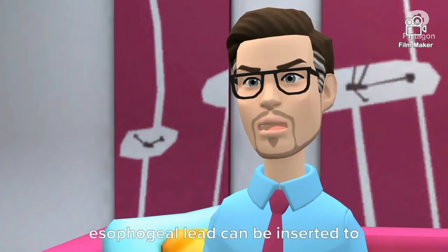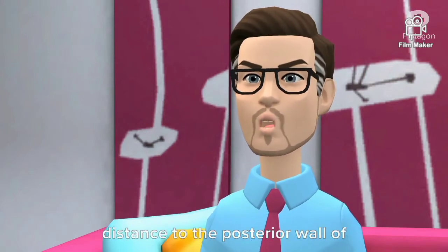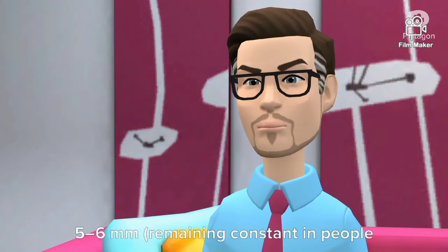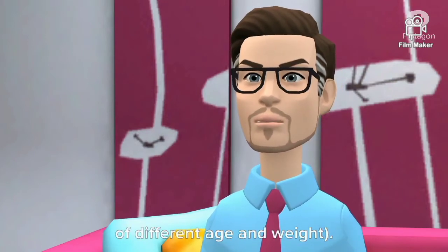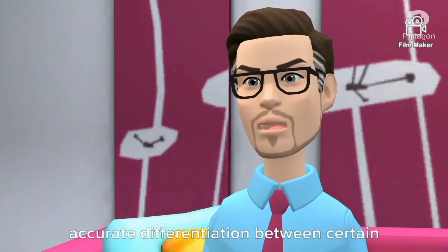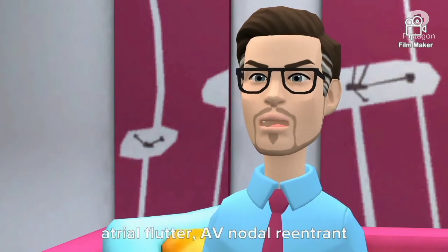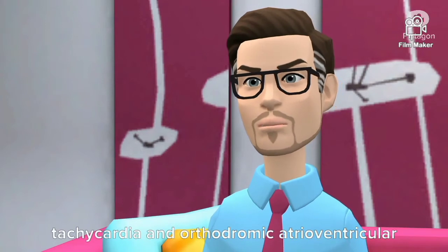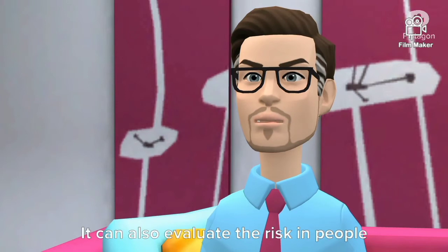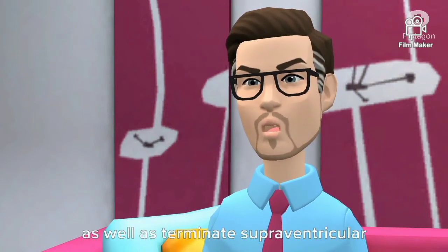An esophageal lead can be inserted to a part of the esophagus where the distance to the posterior wall of the left atrium is only approximately 5 to 6 mm, remaining constant in people of different age and weight. An esophageal lead allows for a more accurate differentiation between certain cardiac arrhythmias, particularly atrial flutter, AV nodal reentrant tachycardia, and orthodromic atrioventricular reentrant tachycardia. It can also evaluate the risk in people with Wolff-Parkinson-White syndrome, as well as terminate supraventricular tachycardia caused by re-entry.